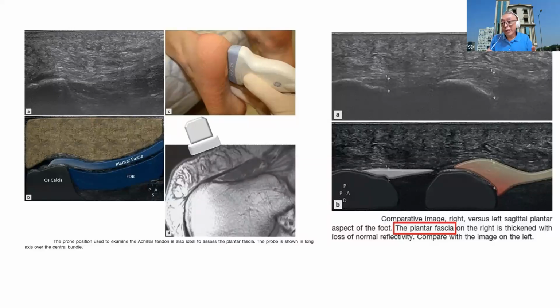In my residency days, I learned this from my teacher, S.N. Bawa. He was a retired brigadier general. I studied in Manipal, Pokhara, my residency in anesthesia, and there he taught me how to use the plastic glove for the probe cover. I still use it. That is an old and gold technique, cheap. I'll show you, everybody.